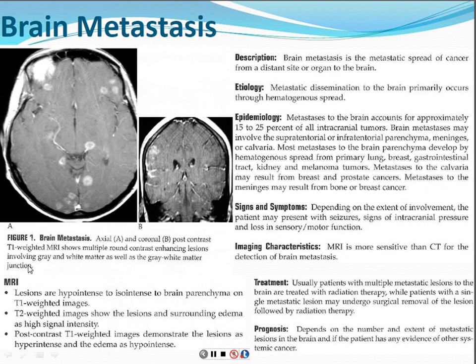The time that you may want to alert the radiologist, you may get alarmed about it, is if you see that one of the lesions is very large, it's pushing structures to one side or the other, down, or really creating a lot of mass effect, we call it, in the brain. They may want to know that sooner or later, especially if you're in an outpatient imaging center, so that they can keep the patient there and maybe get them into the hospital, just to get things moving as far as decreasing it, because you don't want things being moved around too far in the brain. There's not much space. It's a confined space.